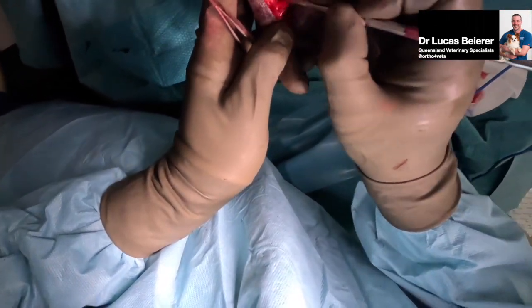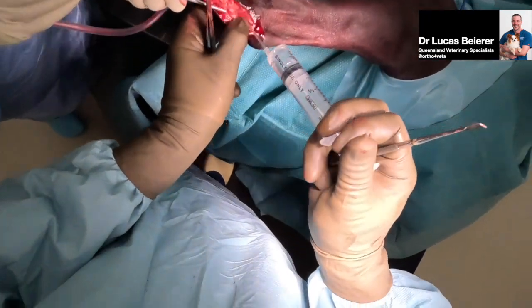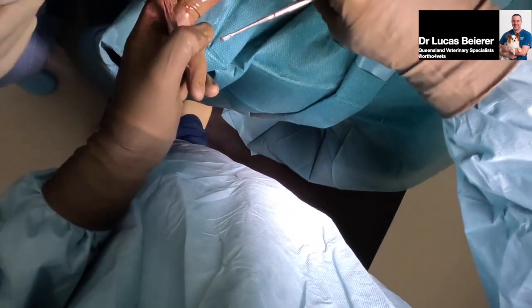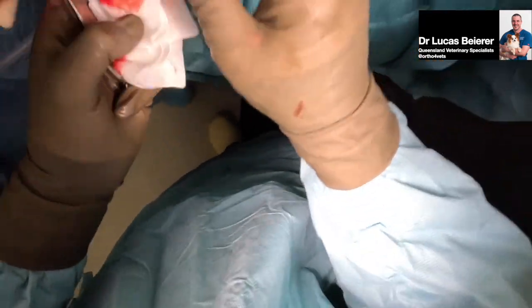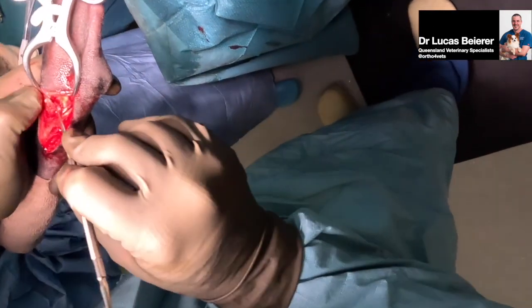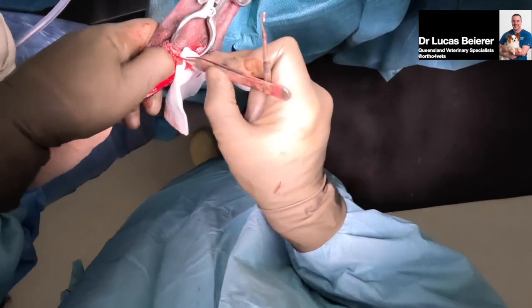Suction. Try and create some vision up there. Let's get some saline. Let's have a feel, mate. I don't think there's actually that obvious a fracture line because it's like a sliver of bone. So let's try with some point-to-points and see if it looks like we can click it in.